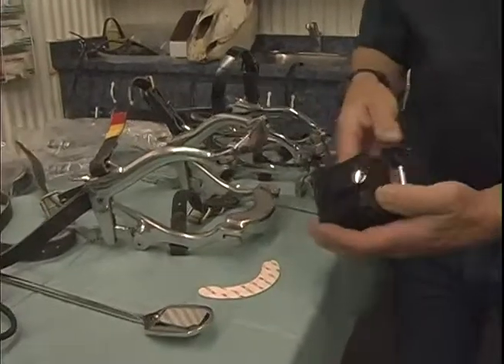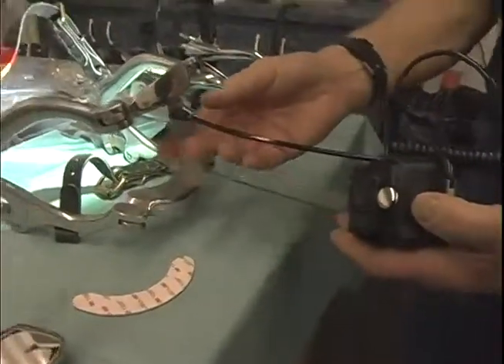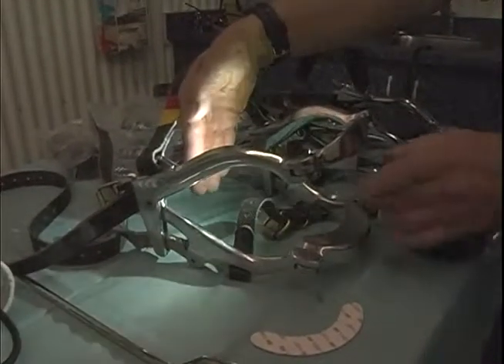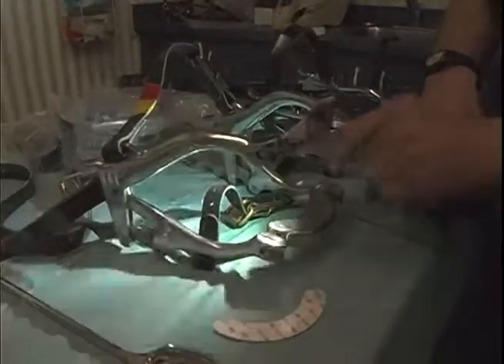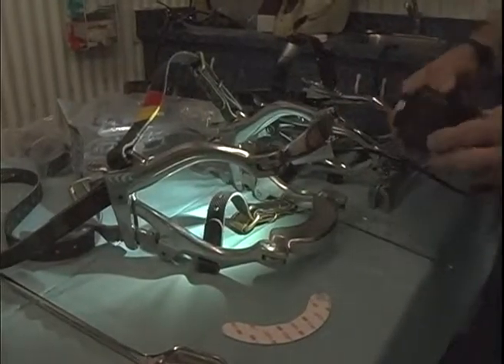The power light is mounted on the horse's head, and there's a switch on the side, and you can see that this is a very, very bright light shining inside the mouth. The power light can be moved around from side to side or easily taken off to put your hand back in the mouth.